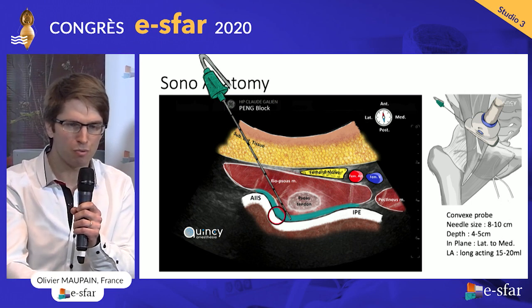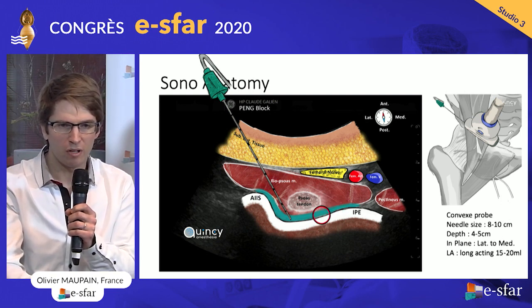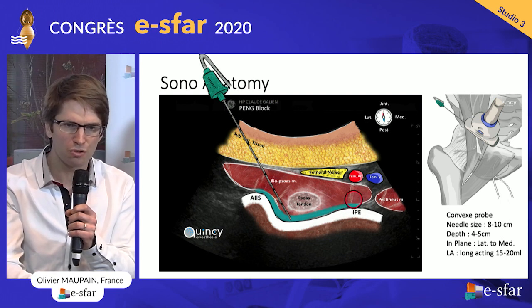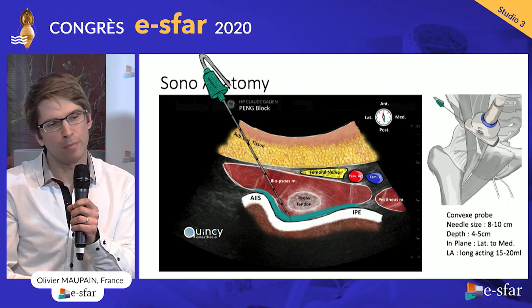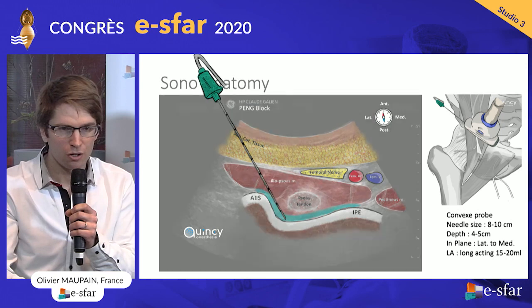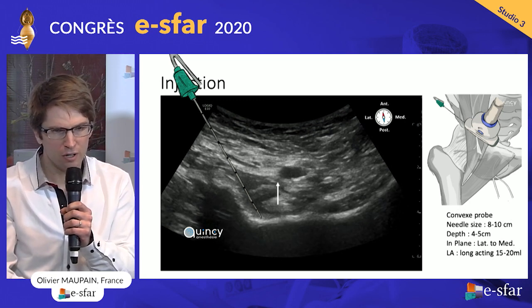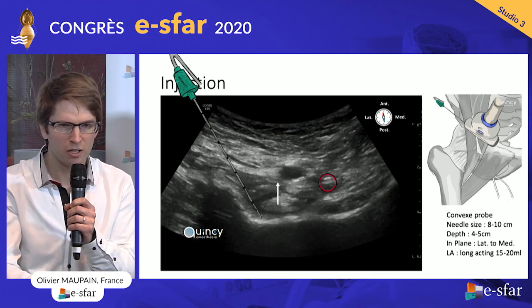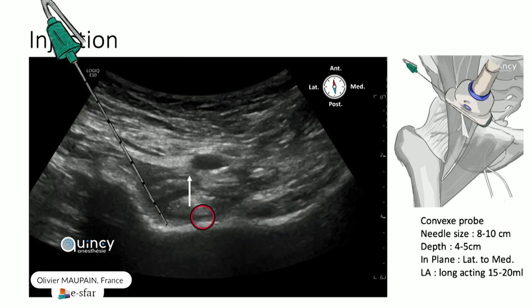The goal is to have local anesthetic spread under the tendon, lift the tendon anteriorly, and spread medially — because if there is an accessory obturator nerve, it will be blocked by a medial spread. When you inject, you have to check that your local anesthetic doesn't travel up to the femoral nerve, otherwise you will have quadriceps weakness. This is supposed to be a motor-sparing block. Here is a short video showing the anterior movement of the psoas tendon as you inject your local anesthetic, with the bony landmarks, femoral artery, and femoral nerve visible.